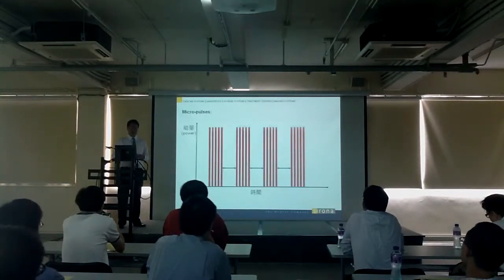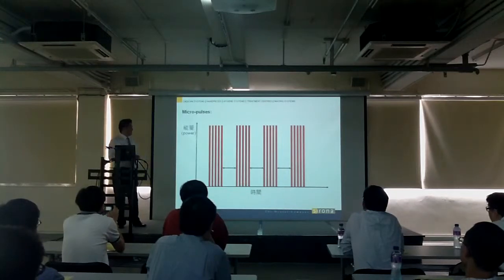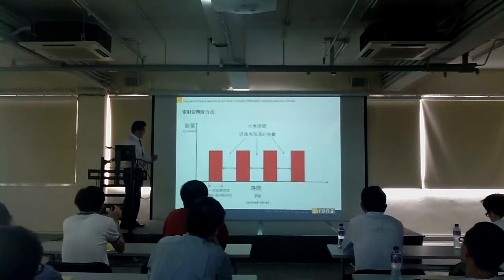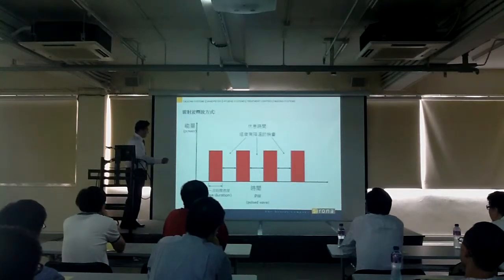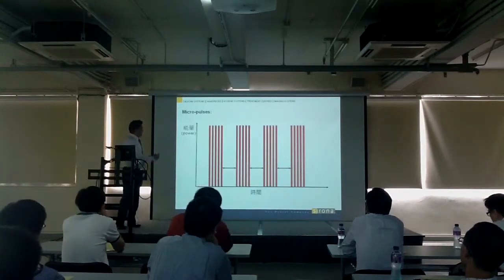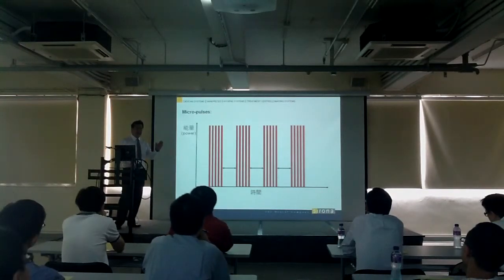So you have both. Now, sometimes certain brands will even do this. Remember, the last graph was one big clump right here. Here it means open, close, open, close. So it's on, off, on, off. Now, sometimes we raise the energy power output, but put in more pulses in between to create a faster cut, but less irritation, less heat buildup. So let's try.